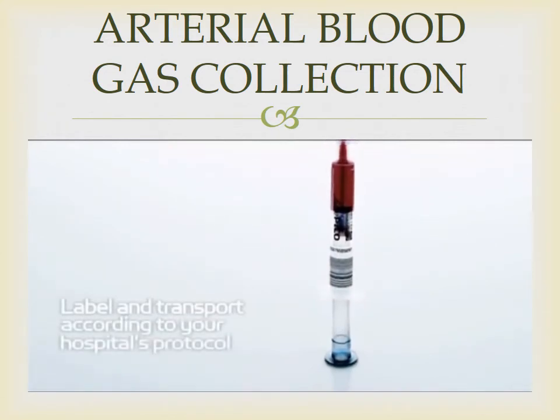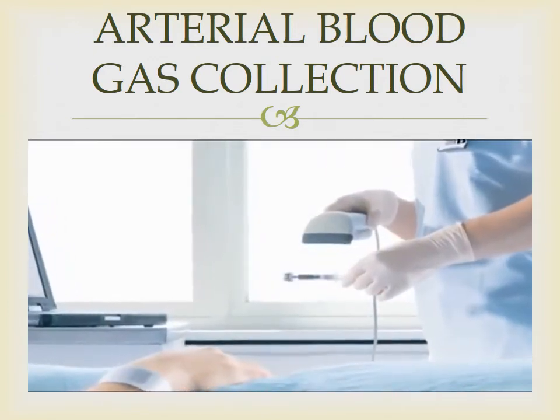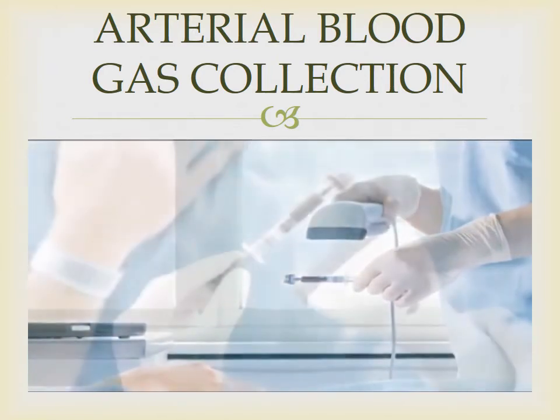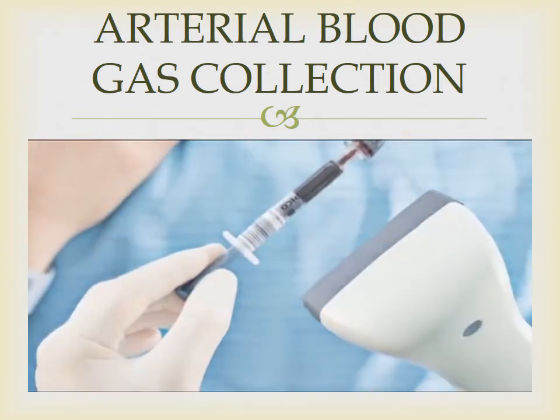Label and transport the arterial sample according to your hospital's protocol to the blood gas analyzer for analysis. The pre-barcoded syringe offers a unique identifier that can be used at the bedside to link the patient and the syringe using Radiometer's Radiance and FlexLink software.